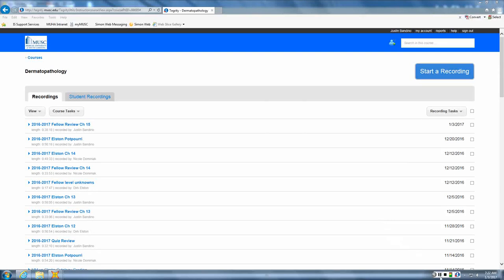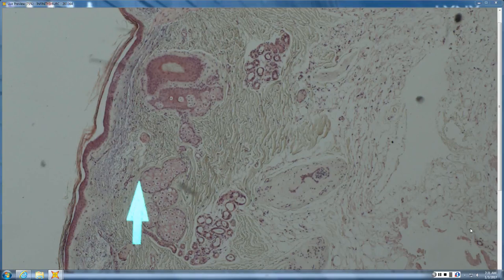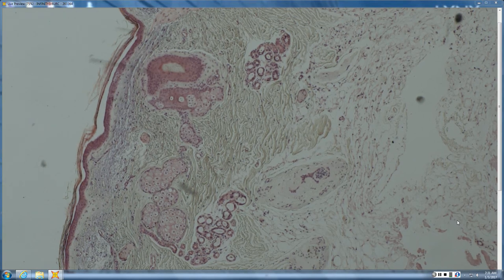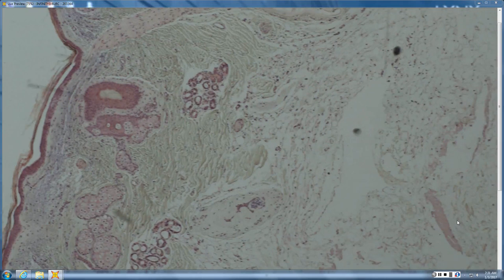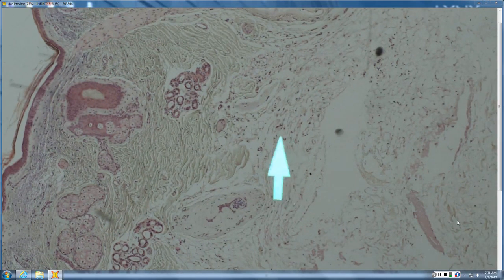I think, because they did shut down for a while. So, the stratum corneum looks fine. Looks like it lost the solar elastosis. There's, looks like the eccrine gland's in fat, or maybe a little bit up. Yeah, they seem a little higher than they should be.